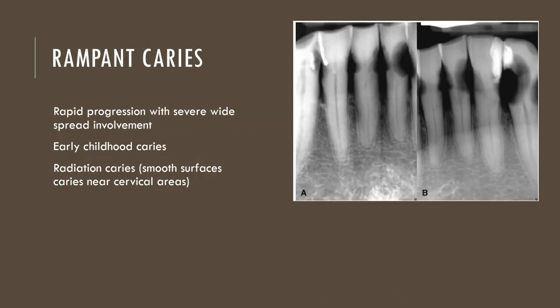The term rampant caries is used for rapidly progressing caries with severe widespread involvement. Early childhood caries as well as radiation caries are types of rampant caries. The image shown is an example of radiation caries in an adult — generally, radiation caries occurs on smooth surfaces near the cervical areas.